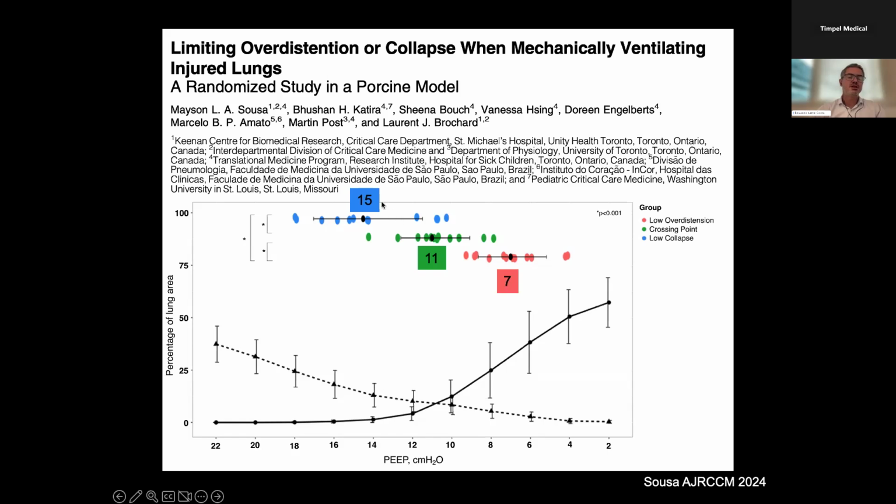And these other two groups were roughly the same in terms of physiological parameters. So you could stay at a higher PEEP level or at an intermediate PEEP level and have results that are basically the same. Slightly better for the group in the middle.